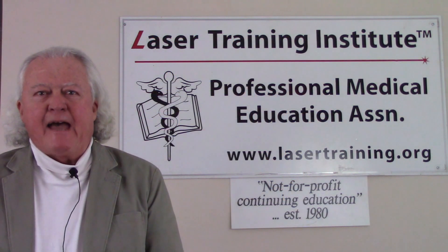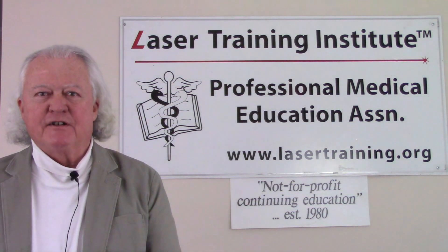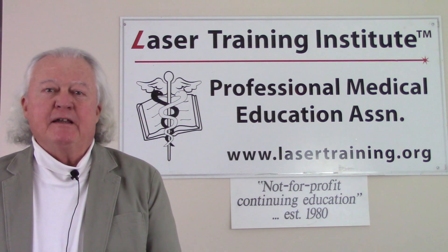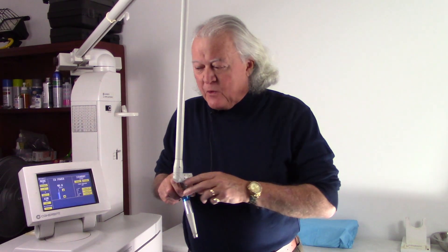Hi, this is Greg Abston from the Laser Training Institute of Professional Medical Education Association. Welcome to our short video series on medical laser training. In this segment we're going to look at the flammability of liquids and a CO2 laser. Some of these are going to be close up so you can actually see what's going on here.